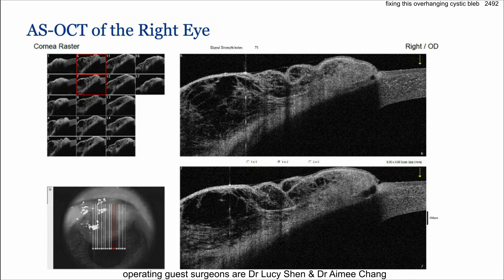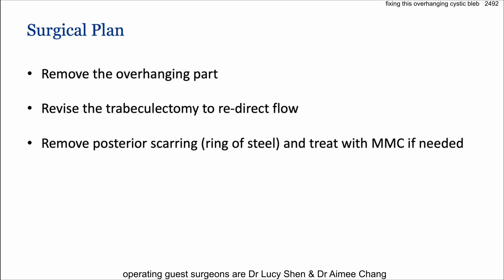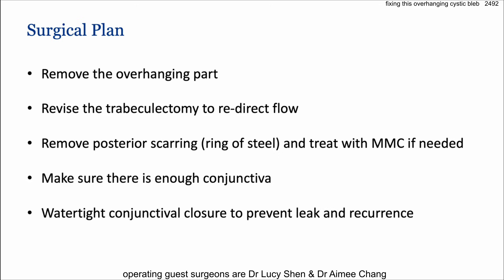Here's an OCT of the anterior segment showing that, luckily, it's not invading the cornea — it's just sitting right on top of it. The plan: remove the overhanging part, revise the trabeculectomy, redirect the flow, remove the ring of steel, treat posterior scarring with mitomycin, ensure enough conjunctiva, and get a watertight closure at the end.